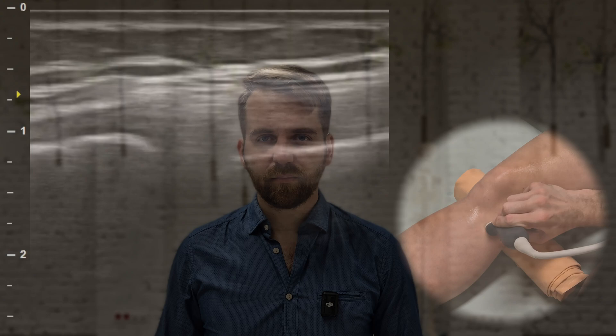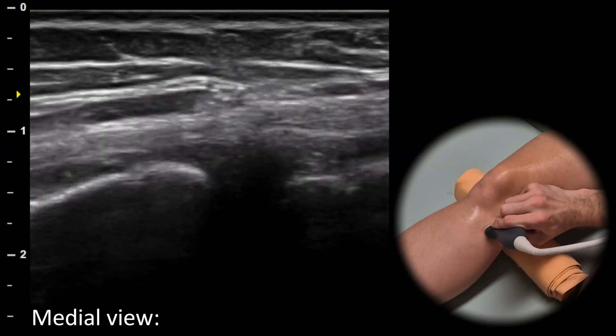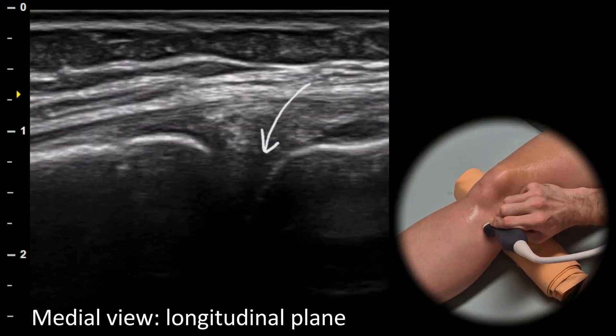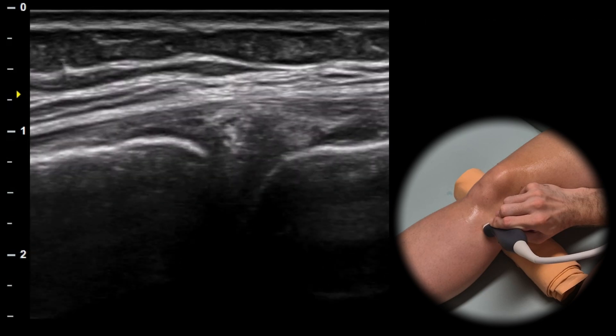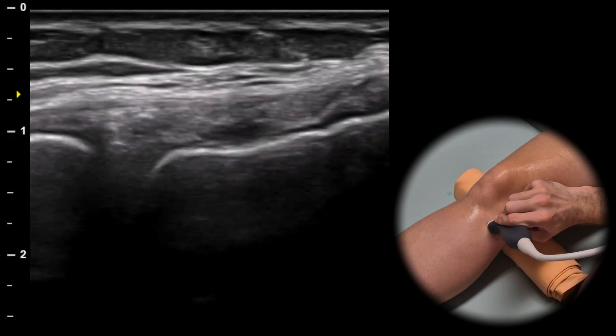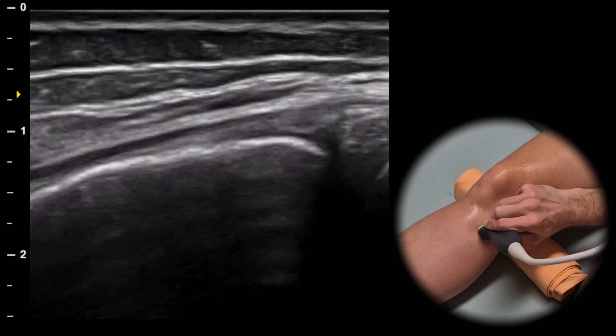The next view is the medial view. In the longitudinal plane we can identify the joint space between the femur and tibia. The triangular structure between these two bones is the medial meniscus. Superficially to the medial meniscus we can observe a fibrillar structure which is the medial collateral ligament. We can follow the medial collateral ligament as it attaches to the tibia.